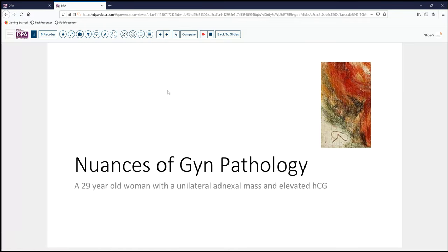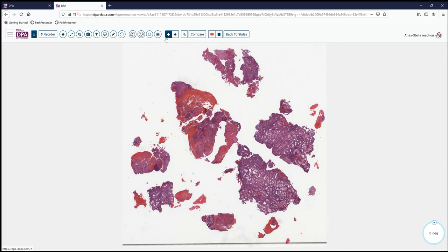Our case today comes from the realm of GYN Pathology. A 29-year-old woman has a unilateral adnexal mass and an elevated HCG suggesting that she is pregnant. Evaluation includes, of course, the possibility that she has an ectopic pregnancy, and that leads to consideration of what may be going on in the endometrium. A curettage is performed, and we receive multiple fragments of endometrium, as you see here — areas of hemorrhage, perhaps some necrosis, some glandular tissue, but no villi.